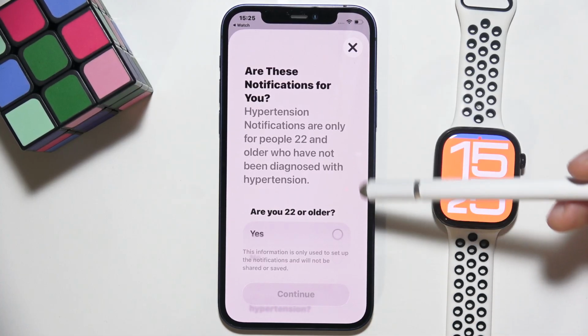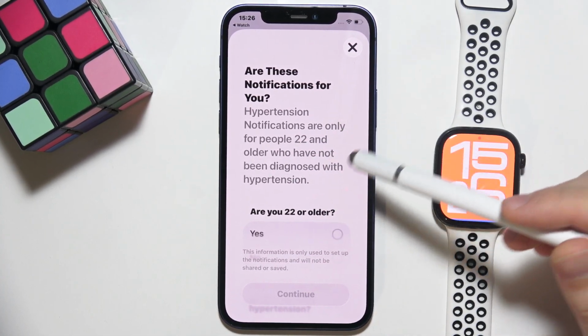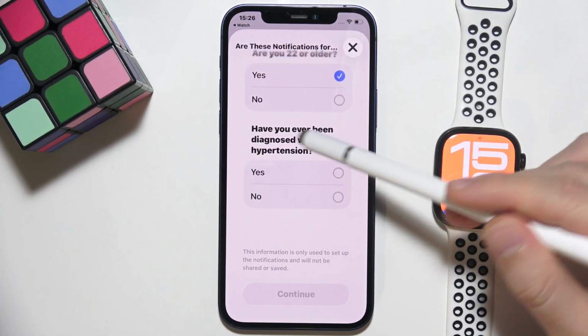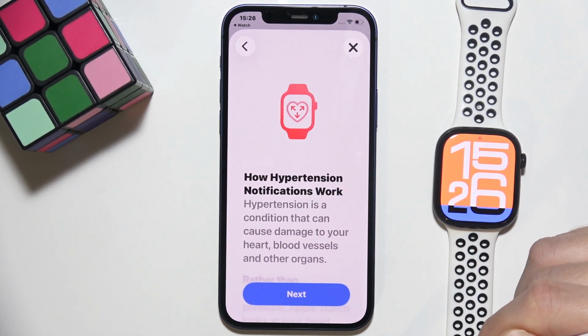Now, as you can see, we have to answer a few questions. So hypertension notifications are only for people 22 and older. So yes, I'm actually older. Have you ever been diagnosed? Nope. We have to click continue.